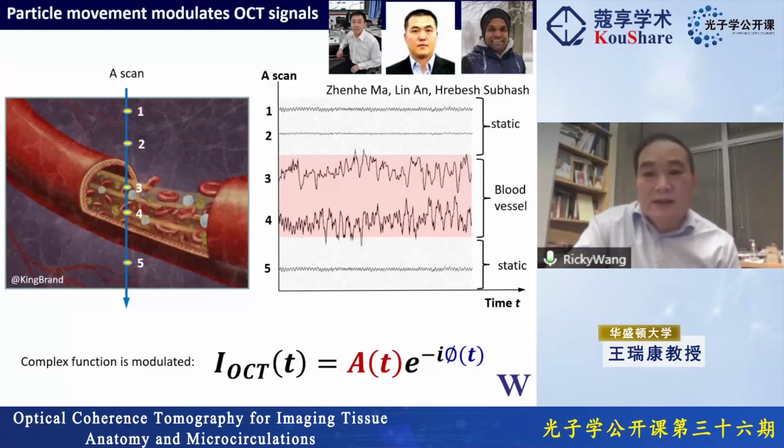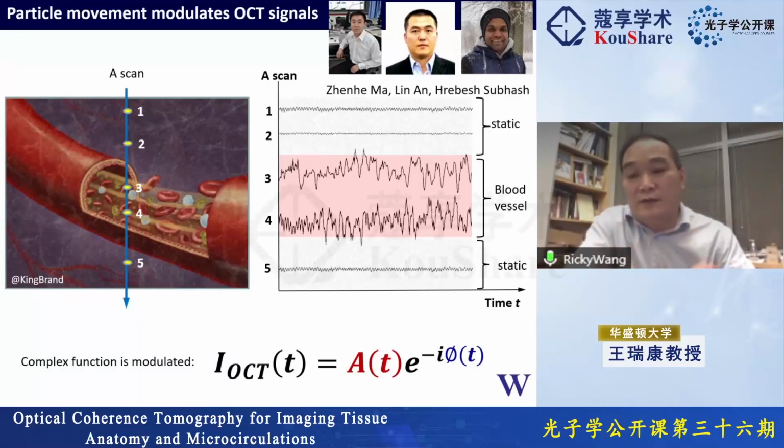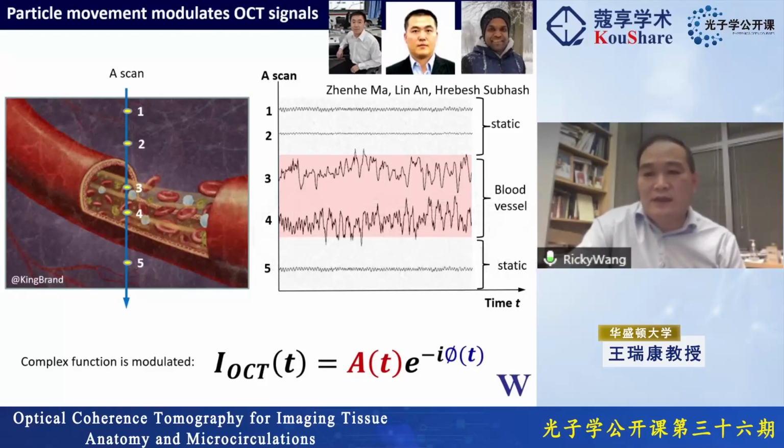To contrast that with the imaging approach, in this case you can only do 2 repeated scans: one scan at time 0 and another scan at time t, right? So for example, over here I got 2 scans. If I do a subtraction of these 2 scans, or basically a differentiation, then at pixel 1, 2, and 5 the signal is static, and differentiation will give you 0, no signal at all.